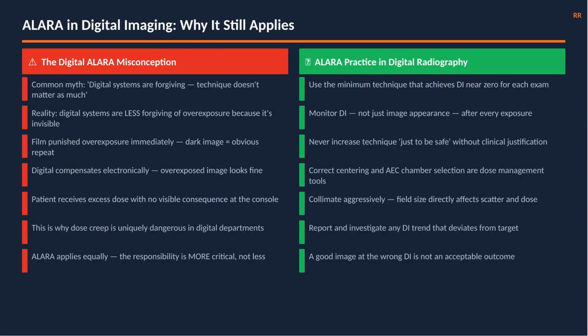The most dangerous misconception in digital radiography: digital systems are forgiving, and technique doesn't matter as much as it used to. The truth is the opposite. Digital systems are less forgiving of overexposure precisely because overexposure is invisible.